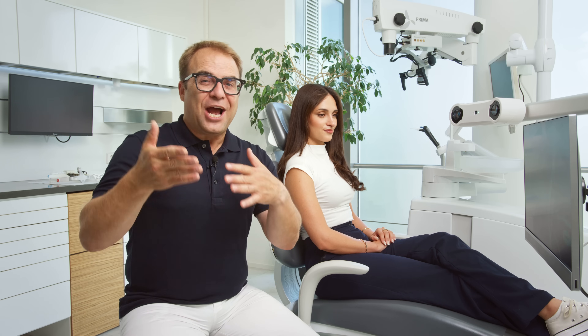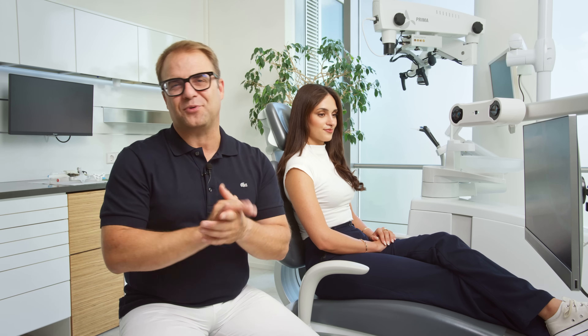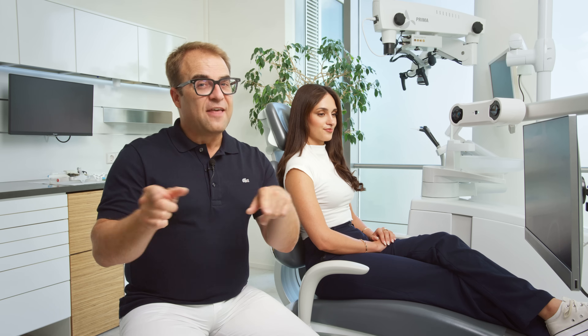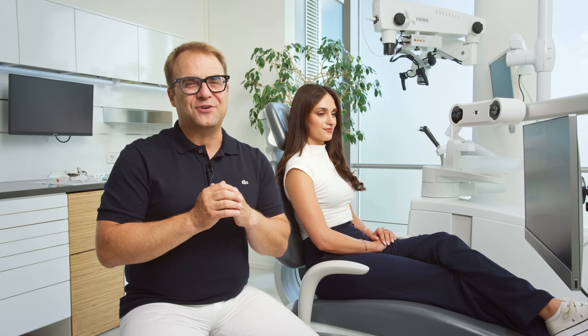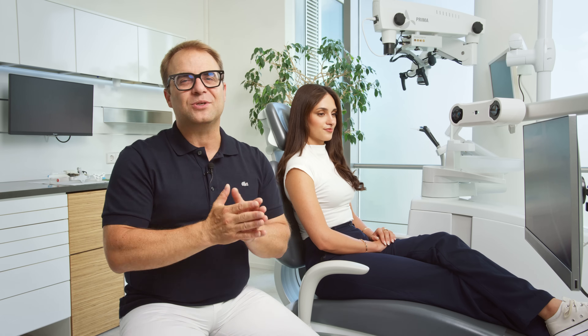Hi everybody! In this video we are going to talk about how crucial jaw motion is for comprehensive digital dentistry and how you can benefit from the most consistent and efficient treatment protocols. High resolution 3D intraoral scans are the gateway to digital dentistry, but there is so much more to discover. By taking static 3D scans and adding motion, you will enter the fascinating world of four-dimensional dentistry.